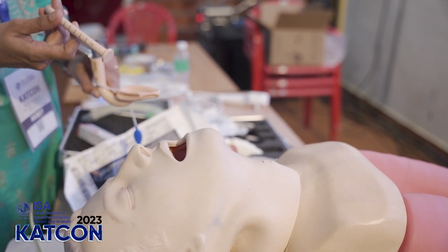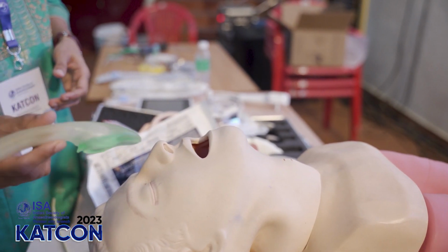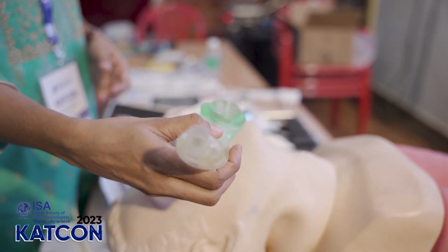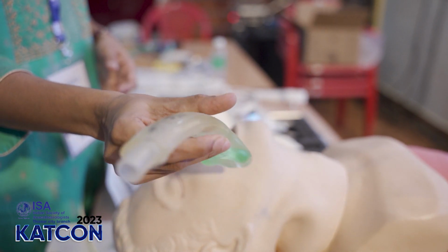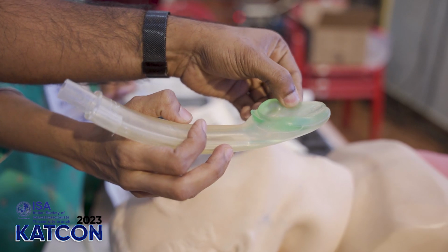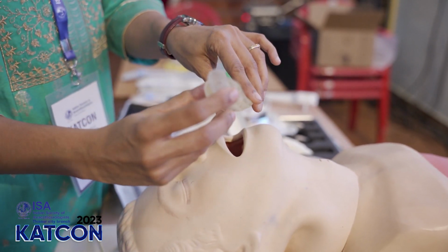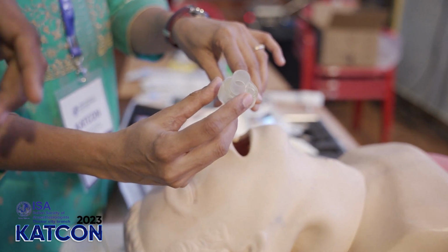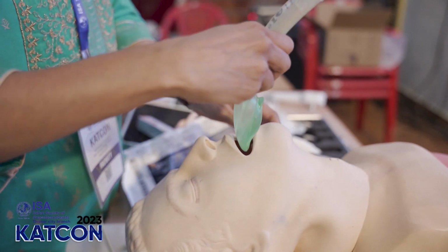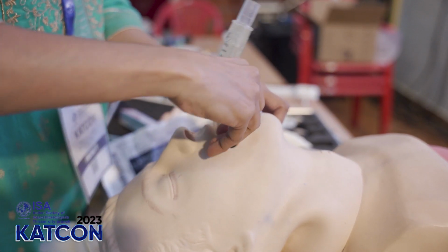Next one is iGel. Here things are much easier because there is no cuff. You can see that there is no pilot balloon, no cuff. Instead of the cuff, there is a special thermoplastic elastomer gel. So that will seat itself, and its insertion is very easy. You just simply insert it just like an LMA, and the gel seats itself into the oropharynx.